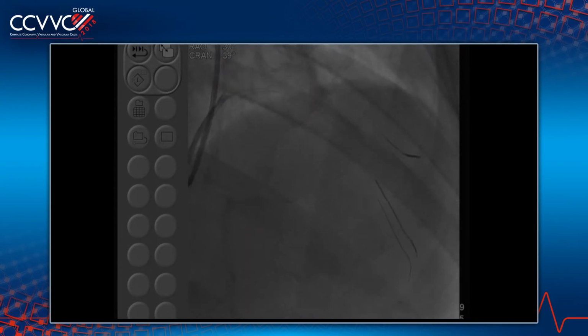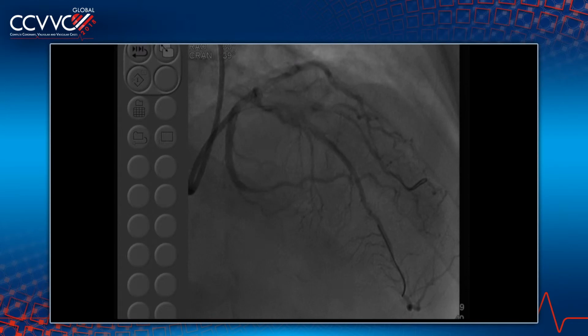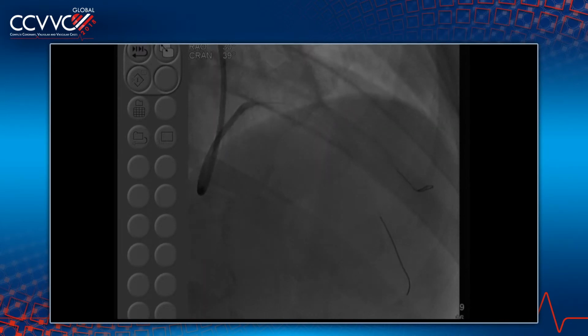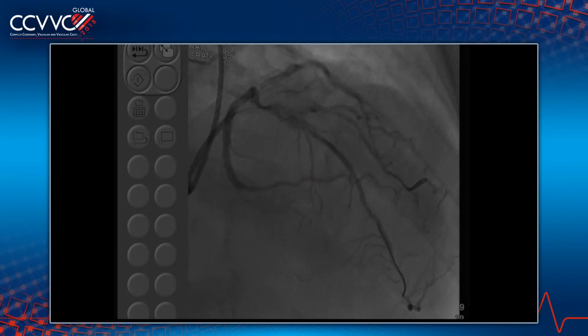We will have to show you the steps of DK crush now. We already showed you the steps of mini crush. I think we were chatting and we took this out. Okay. I think DK crush. And I agree with Ron because of where the wire goes through and the strut coverage. Is that why you favor DK?